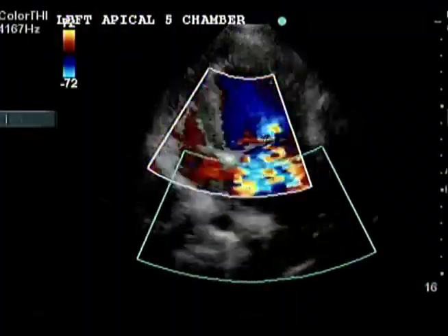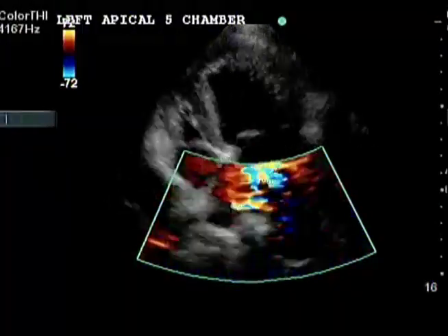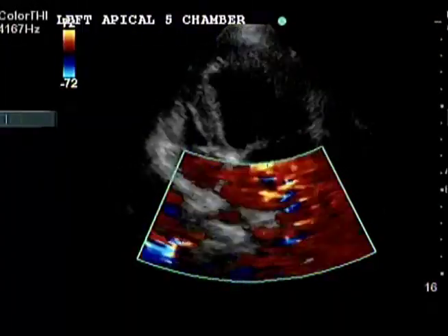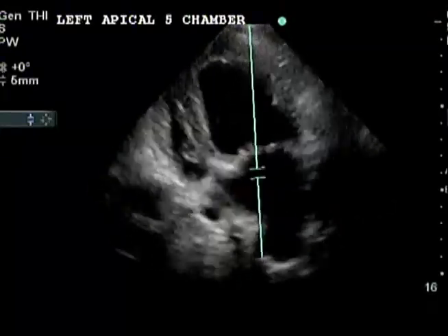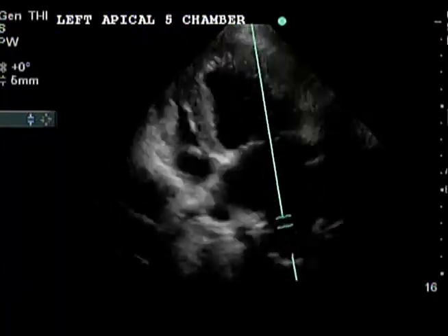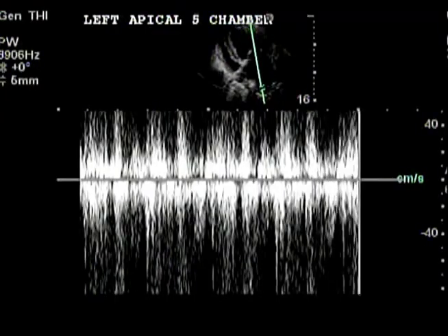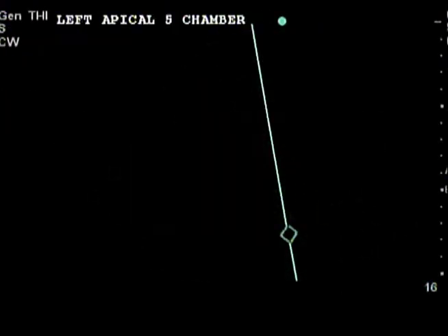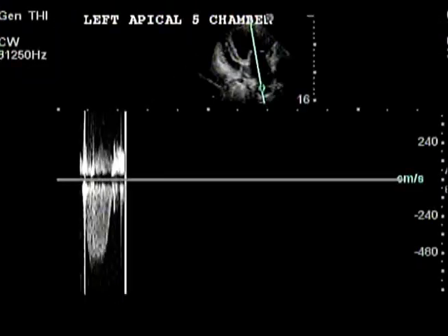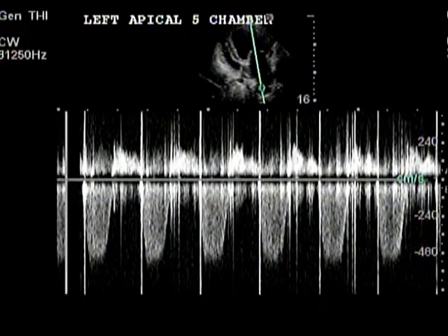In severe mitral insufficiency, the large defect of the mitral leaflet allows blood flow in the left ventricle to accelerate prior to passing retrograde through the mitral valve. Flow velocity in the left ventricle before the mitral defect is no longer negligible, but the simplified Bernoulli equation does not account for this change.